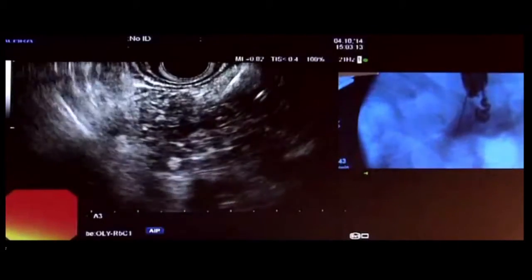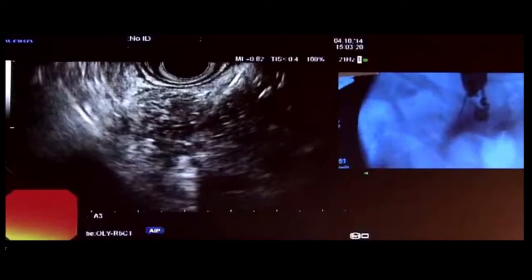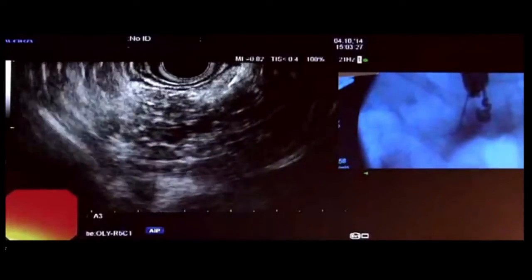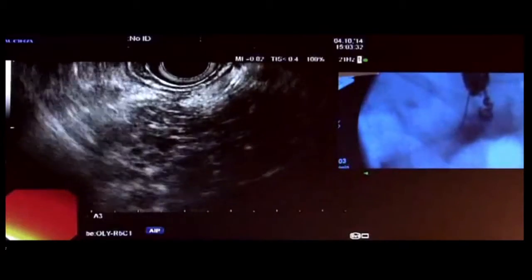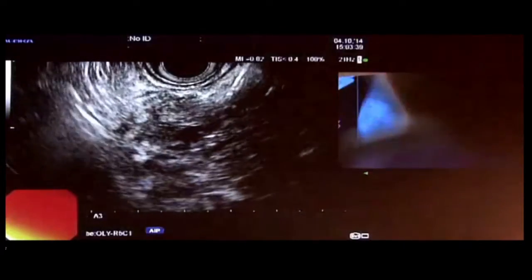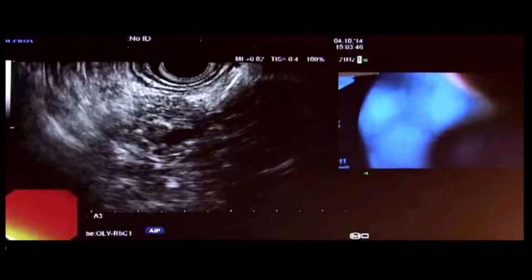There it's going that path again, right? Yeah. Question is, is that path to the duodenum? It may be. Let's see if it starts to coil down and do what looks like the duodenum. It looks like it, doesn't it? Yep, advancing. It looks like it. I'm advancing. Let's see if we can move it down so we can see further down. It could be that the duct is just so long.